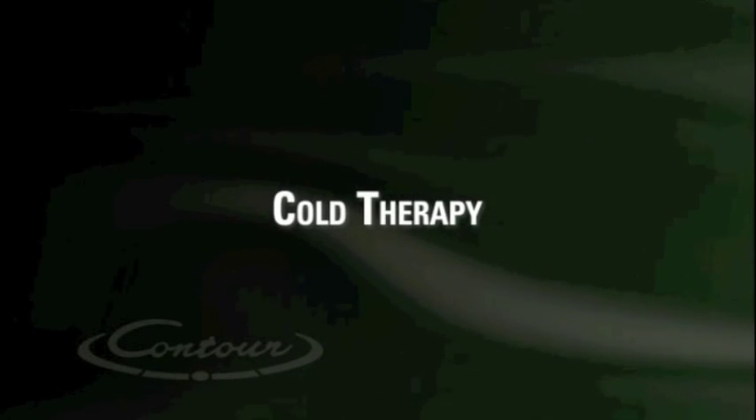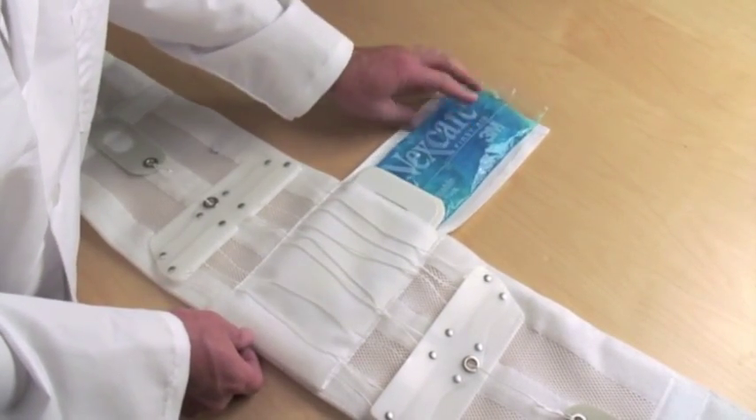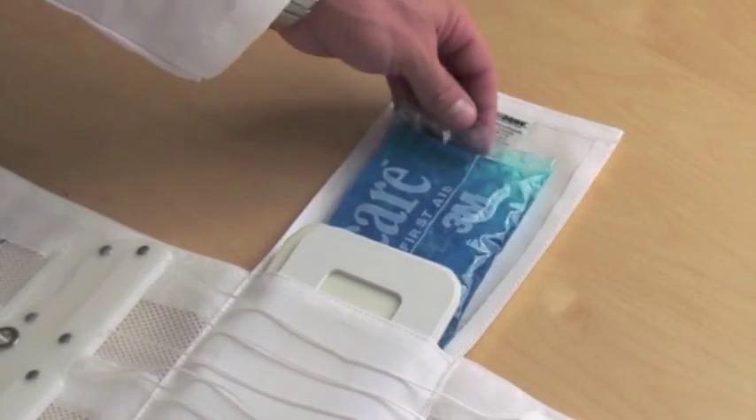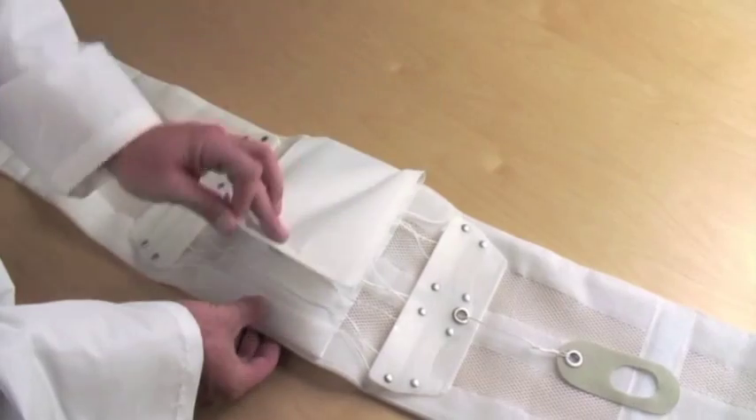Cold therapy. The Quickdraw is designed with a versatile back pocket to accommodate a cold therapy pack if desirable. Pick one up at your local drugstore, or contact Aspen Customer Service to purchase one.